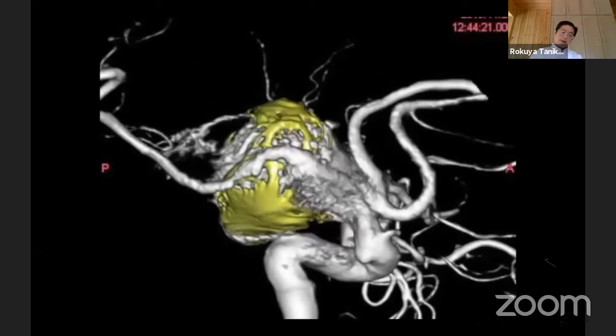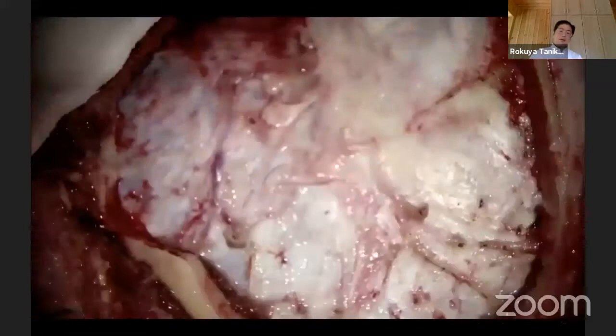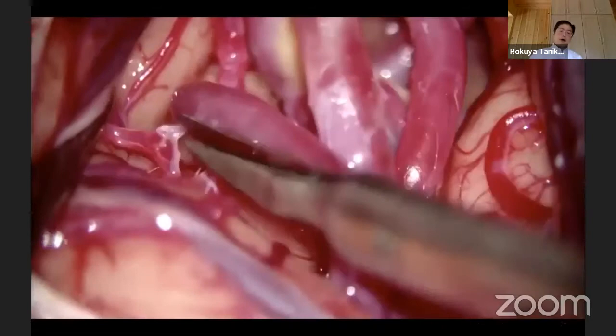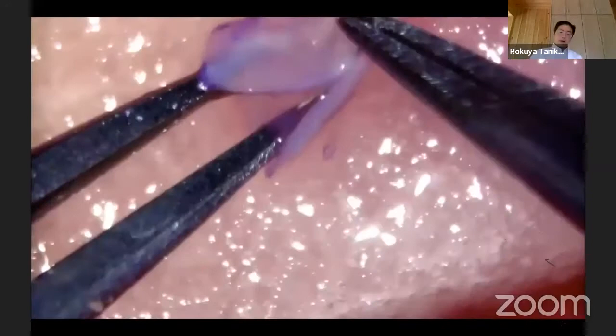This is the neck preparation before opening the head. Then the STA is prepared. Fronto-temporal craniotomy is performed. This is a trans-sylvian approach to explore the whole M2 segment, M1 segment, and the aneurysm. This is the preparation for an STA-MCA bypass on the M3 segment.